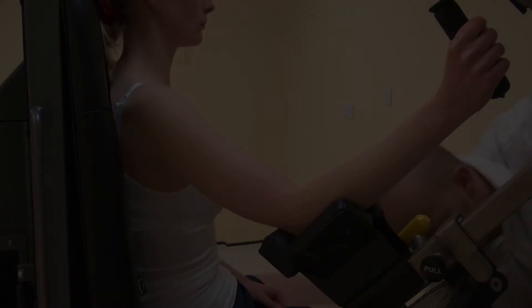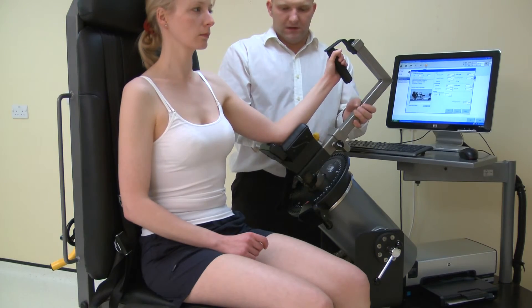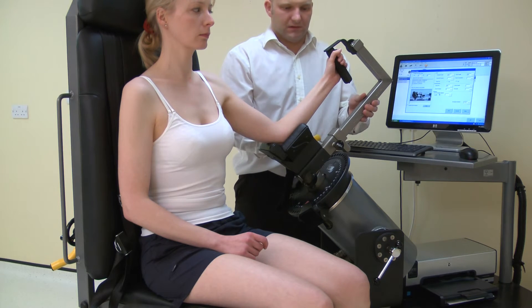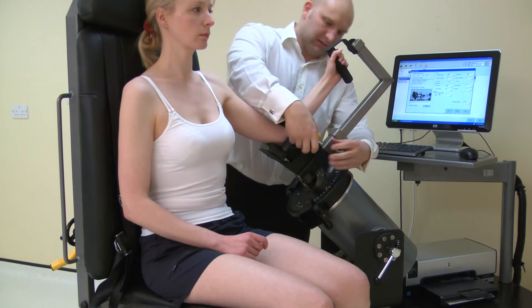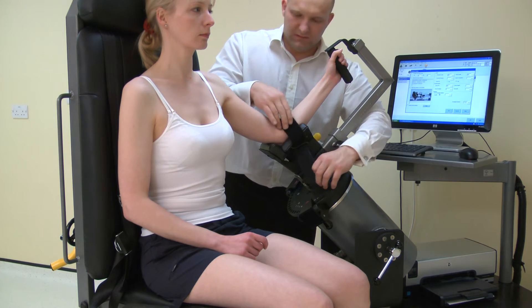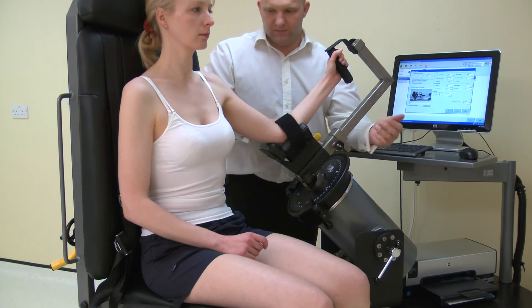Now position the hand grip. Loosen the screw and slide to a comfortable position for the subject. Secure using the screw before beginning the test. Secure the forearm strap to hold the elbow into the stabilizer.